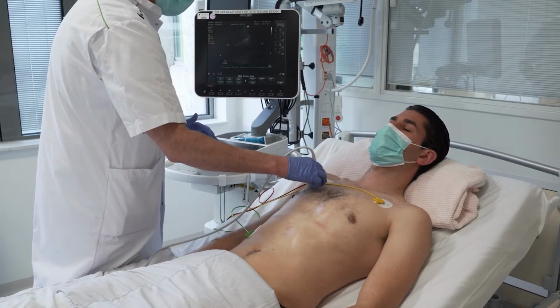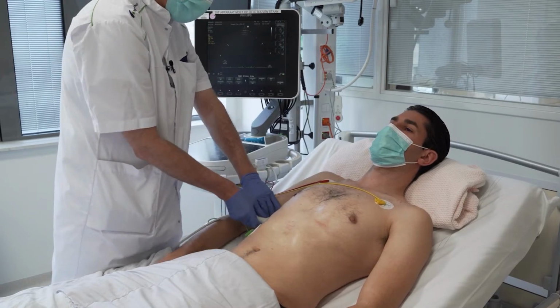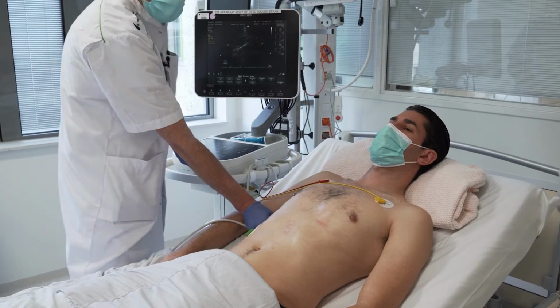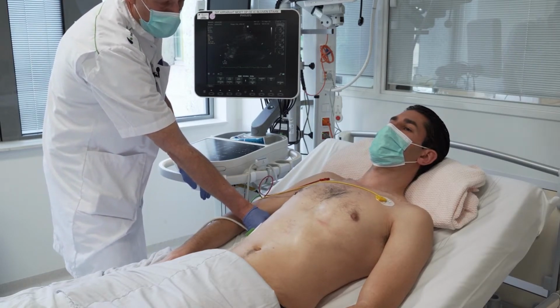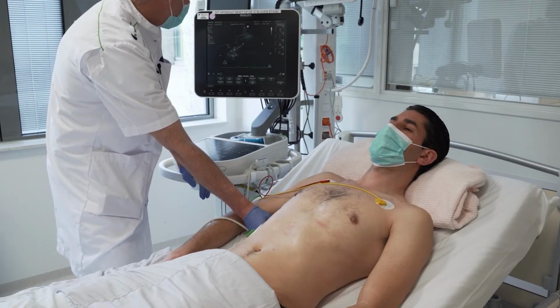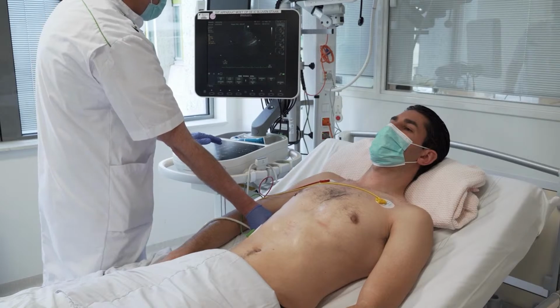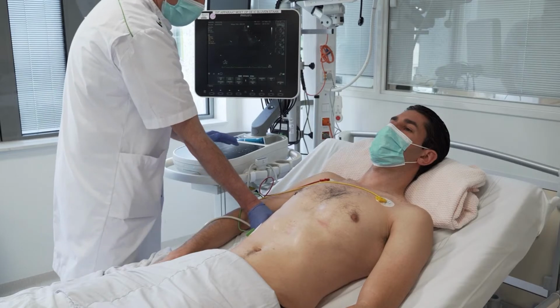From here I usually go to the right upper quadrant, and you really need to put the probe as dorsal as possible, really nearly on the bed. Again, I am playing with the probe.